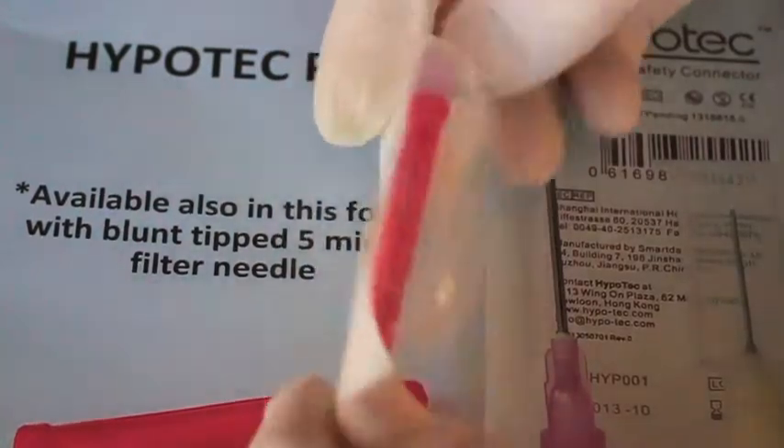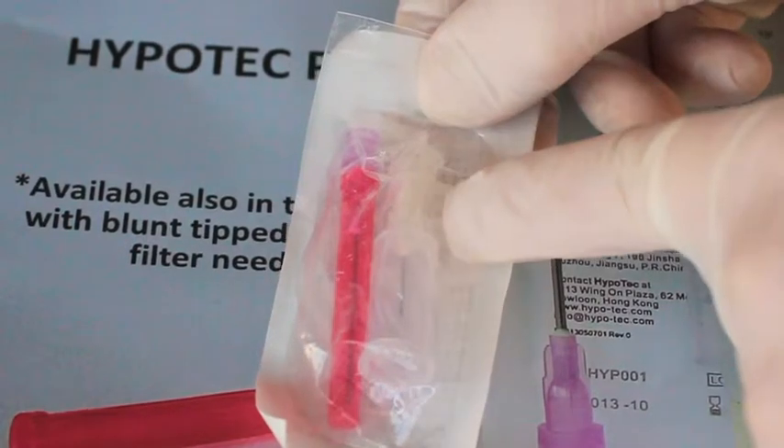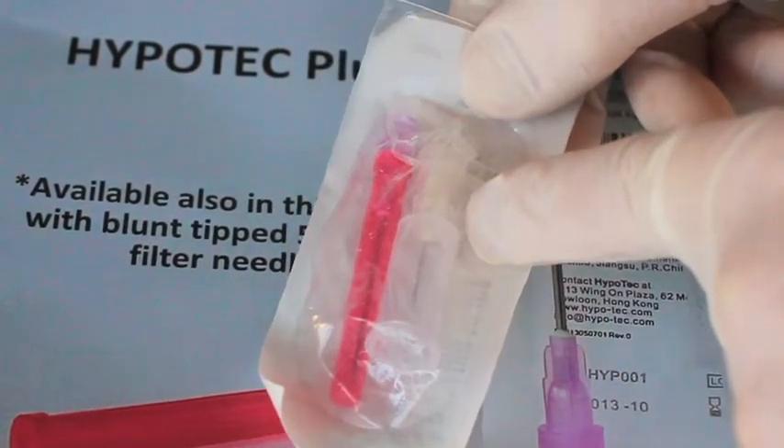Both the filter drawing up needle and Hypotec are conveniently placed side by side within the pack for easy and safe aseptic access.